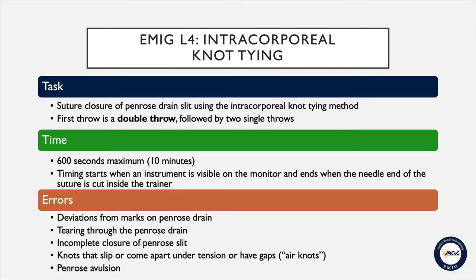The maximum time limit for this task is 10 minutes or 600 seconds. Timing will begin when an instrument is visible on the monitor and ends when the needle end of the suture has been cut from the completed knot inside the trainer. Errors will include any deviations from the marks on the penrose, tearing through the penrose, or incomplete closure of the penrose.